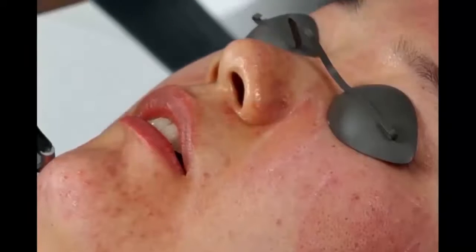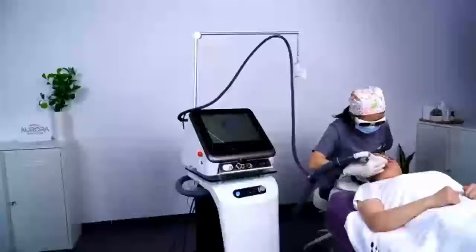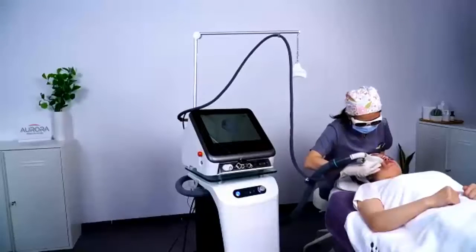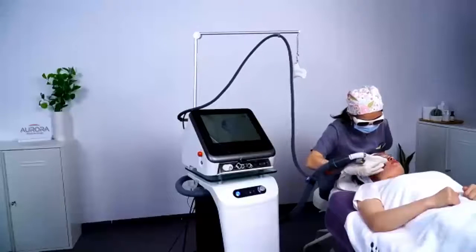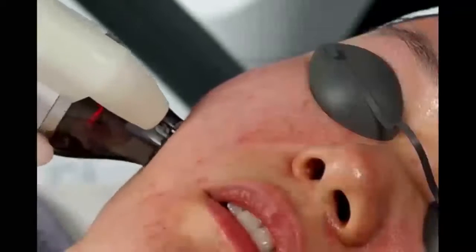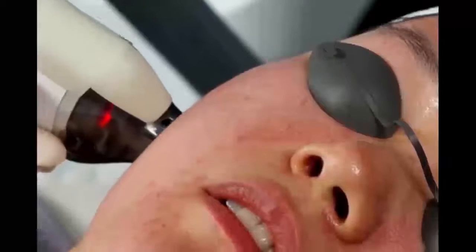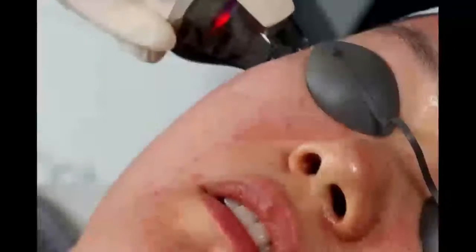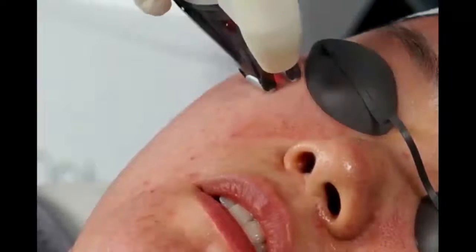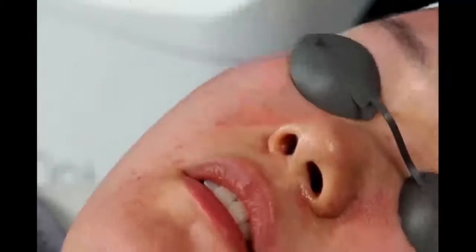It's better to avoid the areas we already treated, to avoid extra energy on the skin.